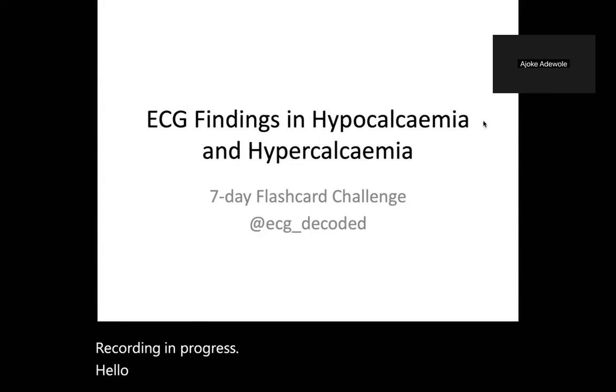Everyone. Today we're going to be discussing ECG findings in hypocalcemia and hypercalcemia.